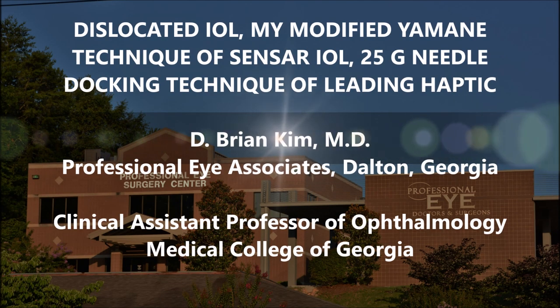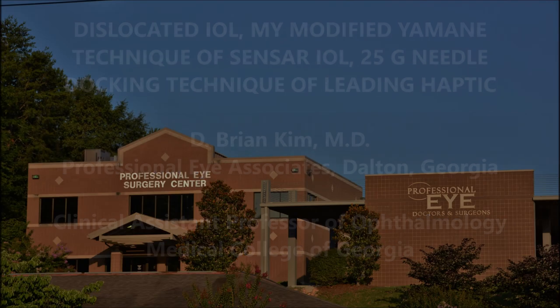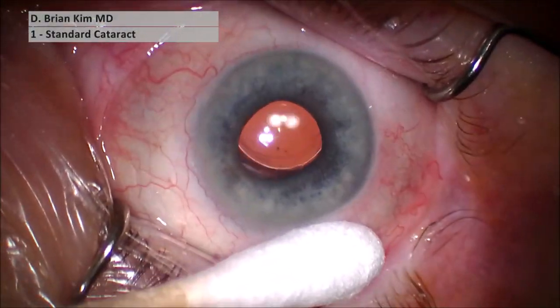This is Brian Kim. I want to share this case of a patient referred to me for a dislocated IOL. I performed a lens exchange as well as my modified Yamane technique externalizing the leading haptic for easier trailing haptic fixation. I used the Sensar IOL, which has very delicate PMMA haptics. To externalize the haptic atraumatically, I developed this 25-gauge needle docking technique. I did run into a little trouble placing the needle at an awkward angle, so you'll see one small complication. This is all learning when doing these techniques.